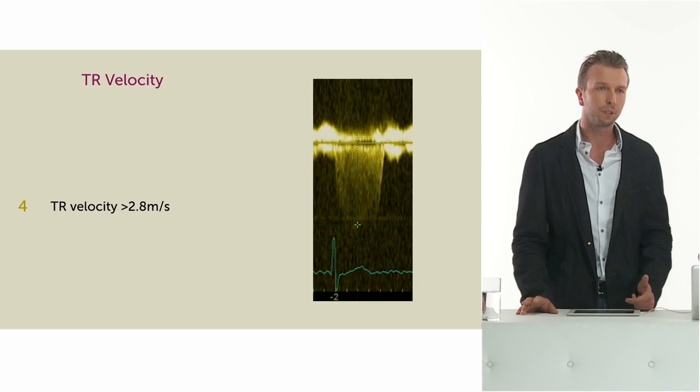Mm-hmm. So in other words, if you have a patient who has pulmonary vascular disease, precapillary pulmonary hypertension, that would be one of the causes of this. So keep this in mind. But you said correctly, the cutoff value is 2.8, right? Yeah, that's the cutoff. If this criterion is fulfilled, you have the possibility with the 4 parameters we just told you to make the diagnosis whether there are elevated filling pressures or not, diastolic dysfunction or not, in subjects with normal ejection fraction. Yeah.